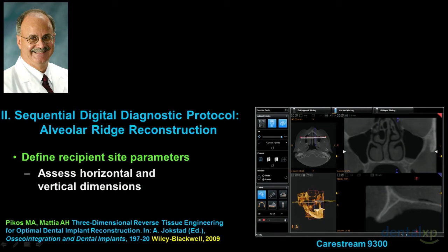We have a big flat panel in every room. And I engage the patient immediately by saying, "Mrs. Jones," and they can appreciate a panoramic view. "This is you. I'm looking right at you from right to left. If we slice anywhere here, it's like having an apple in my hand. I slice it in half, I turn it 90 degrees, and I'm looking at the core."